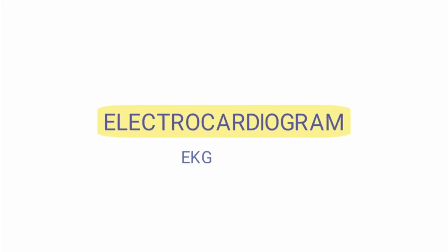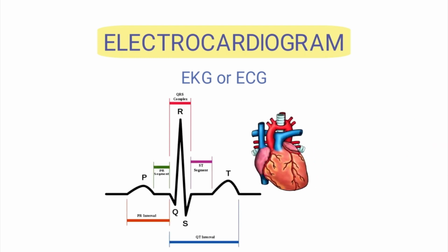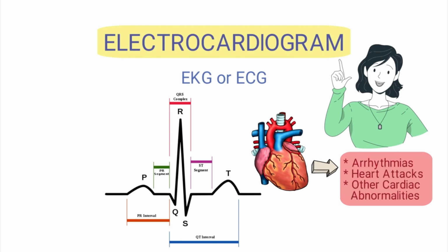An electrocardiogram, often abbreviated as EKG or ECG, is a test that measures the electrical activity of the heart. This is an important diagnostic tool that can be used to detect a number of heart conditions, such as arrhythmias, heart attacks, and other cardiac abnormalities.